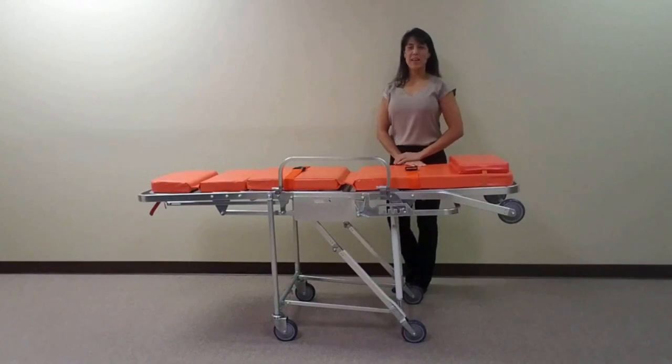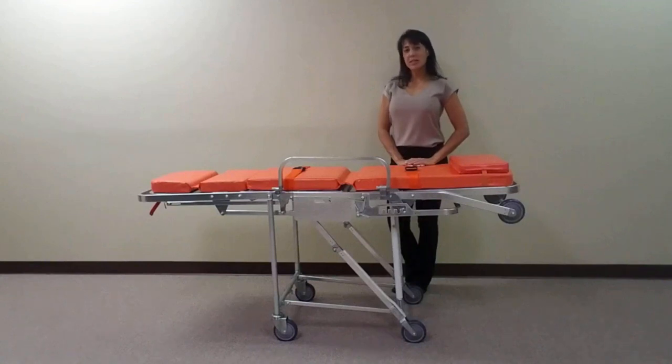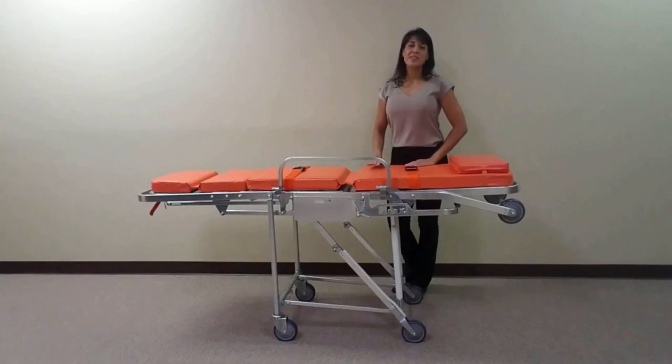We would like to introduce you to the MS3C1000, our lightweight convertible chair stretcher. This stretcher is ideal for transporting individuals to and from appointments. This unit is specifically designed for compact spaces such as elevators and narrow hallways.